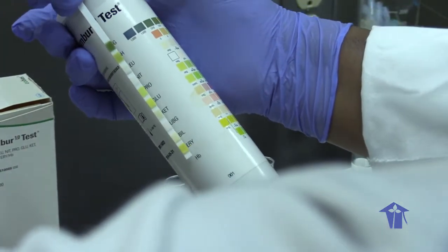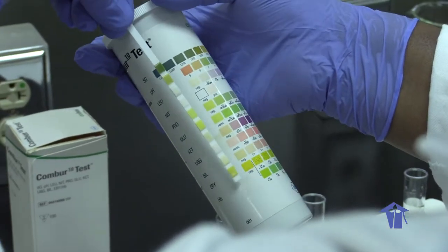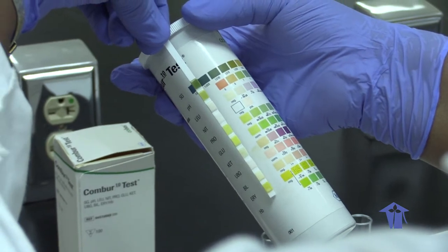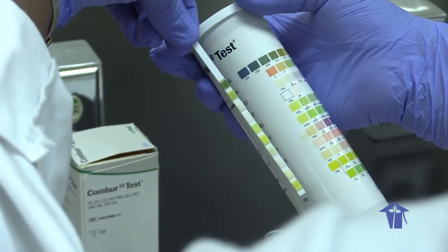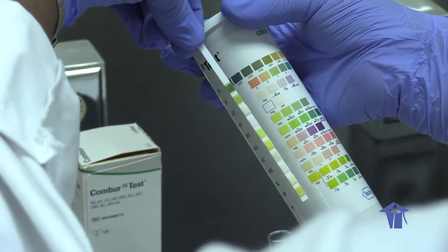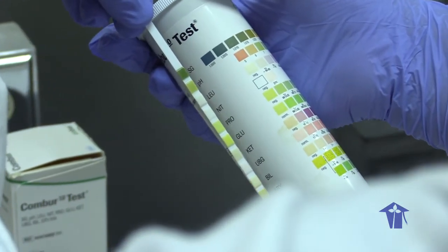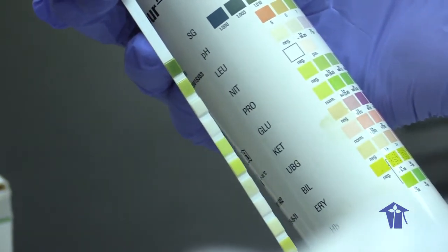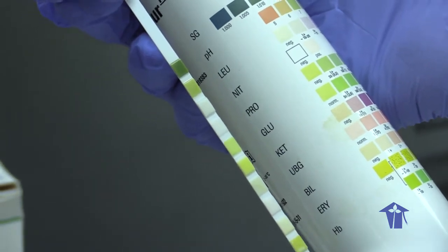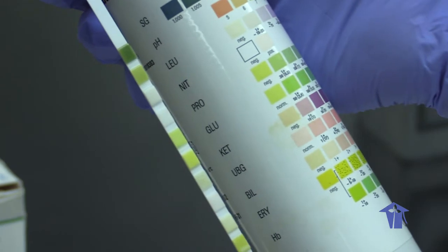So this urine, we can see that the specific gravity, which is your first reading, is 1.010. Your pH is about 8. Leukocytes, negative. Nitrite, negative. Protein, negative. Everything else appears to be negative. So this is a normal urine.